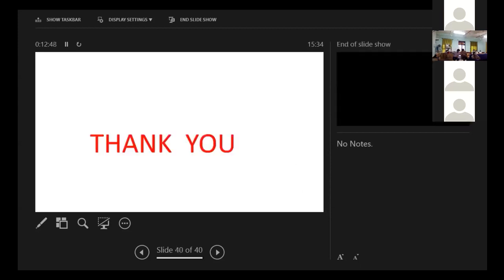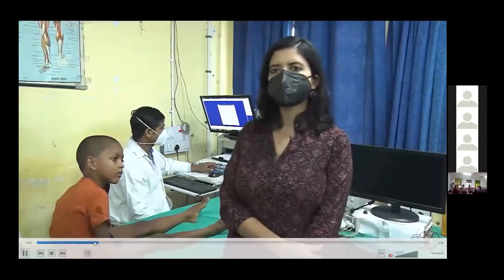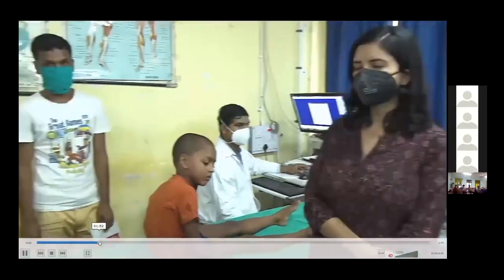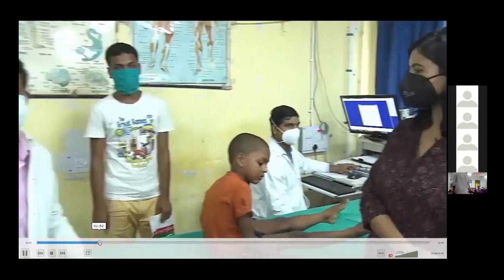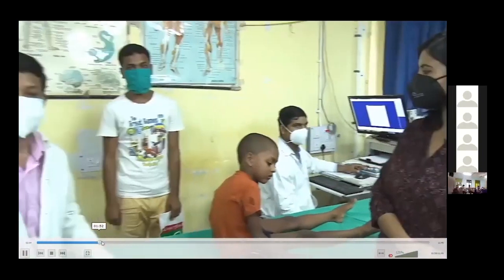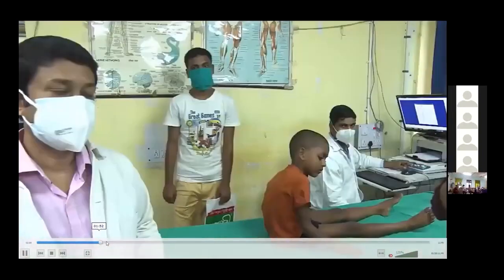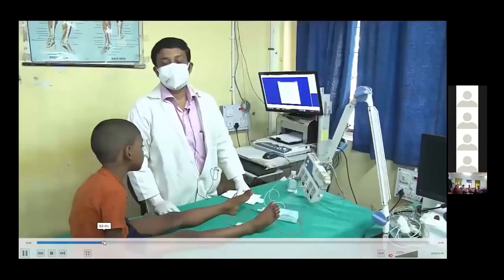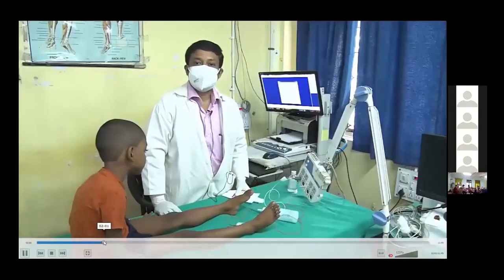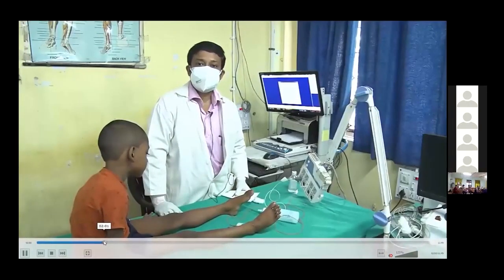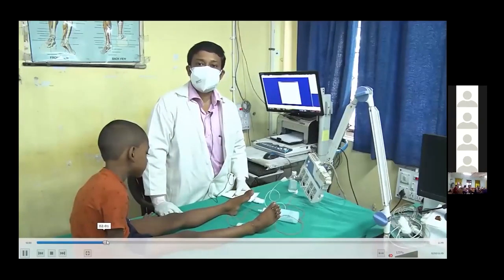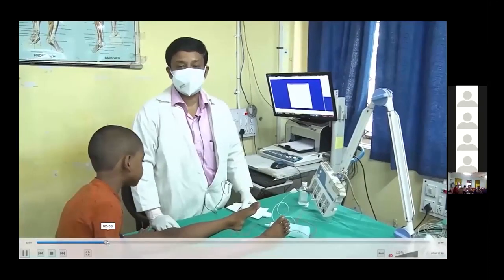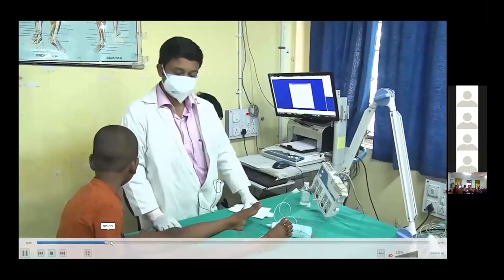We will show our video quickly. We see a child. This child had proximal weakness starting from the lower limbs. So the EMG procedure was being done. The child was more or less cooperative. We can see the calf hypertrophy in this child. So the protocol was done.